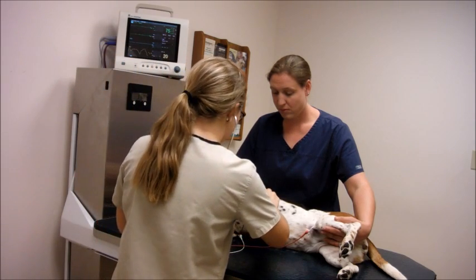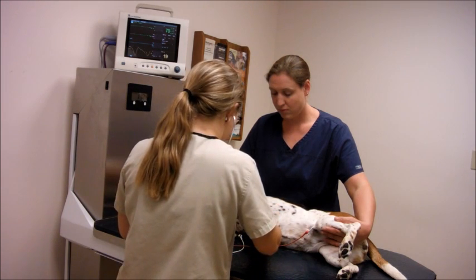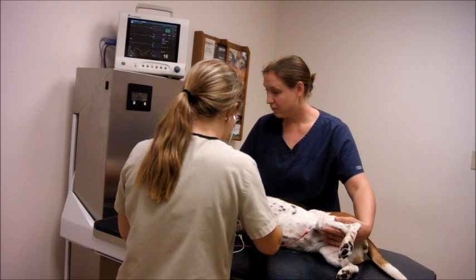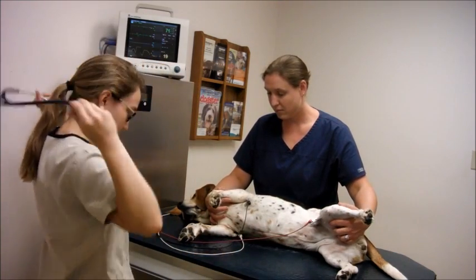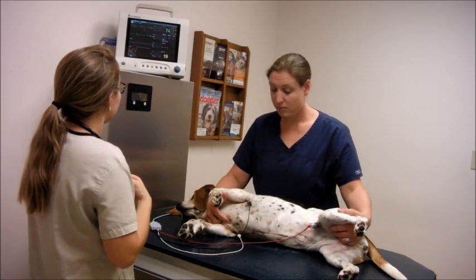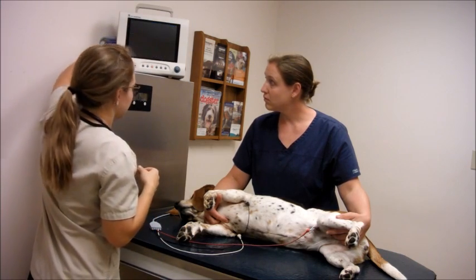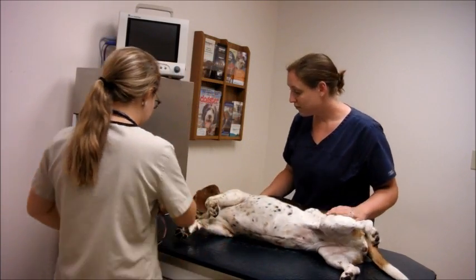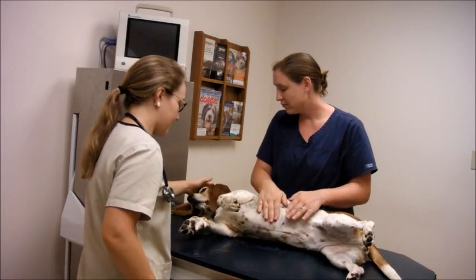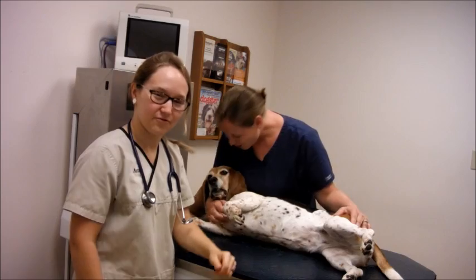Everything sounds really good. I'm going to go ahead and turn off the machine and disconnect the leads so Lola can sit up. The power button is here — I'll go ahead and shut this off. I'll make sure to clean the leads with disinfectant spray and clean up the table. Lola did a great job — she's going to get a cookie! That is how you perform an ECG on a dog.